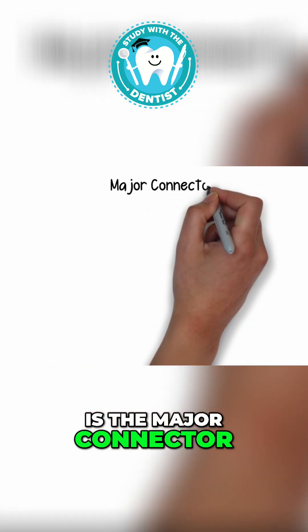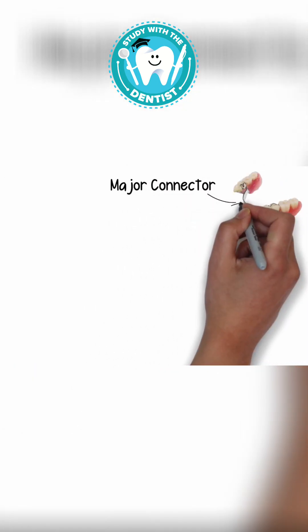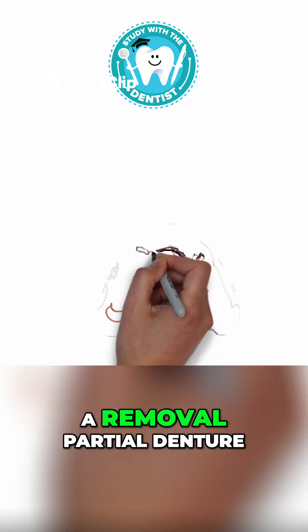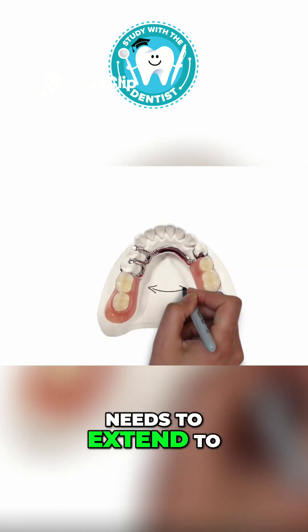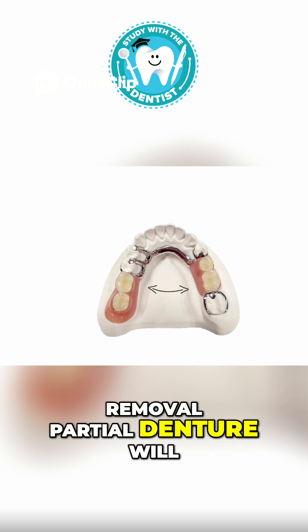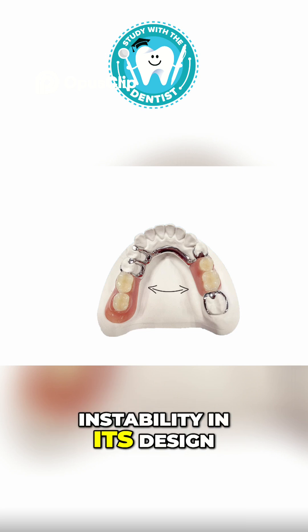The first part is the major connector. In order to have an optimum and stable design, a removable partial denture needs to extend to both sides of the arch, because a one-sided removable partial denture will create a lot of instability in its design.